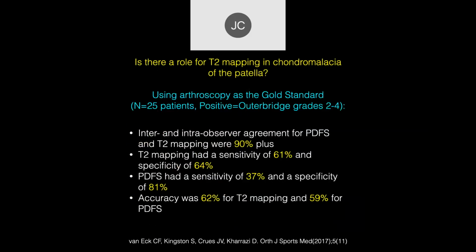So the question is, is there a role for T2 mapping in evaluating chondromalacia of the patella using arthroscopy as the gold standard? Inter-observer agreements for PD fat sat and T2 were very high. T2 mapping had a sensitivity of 61 and 64%.